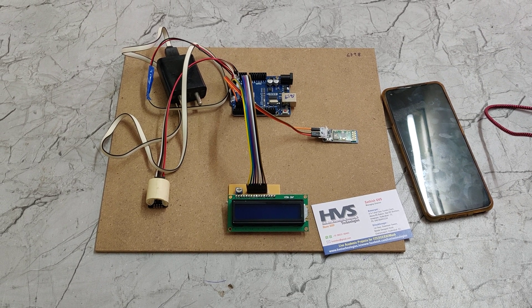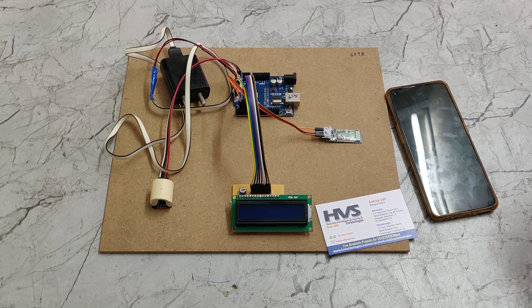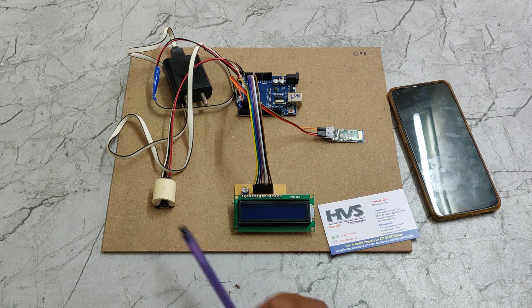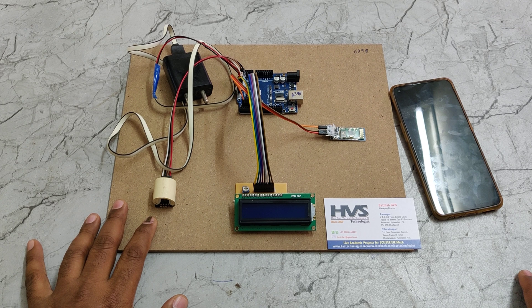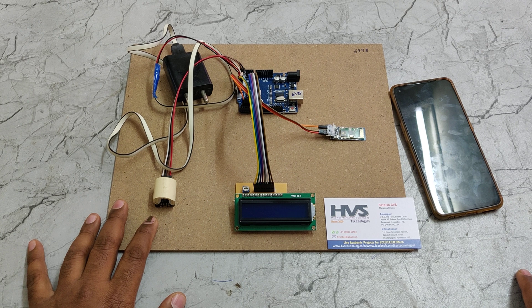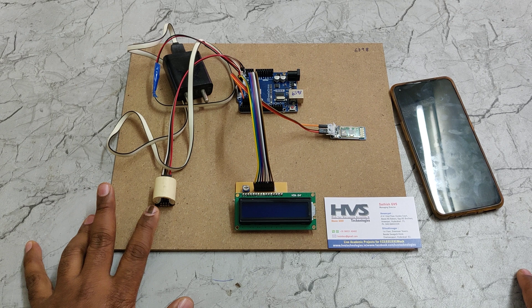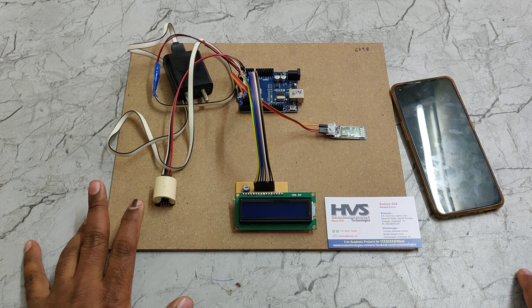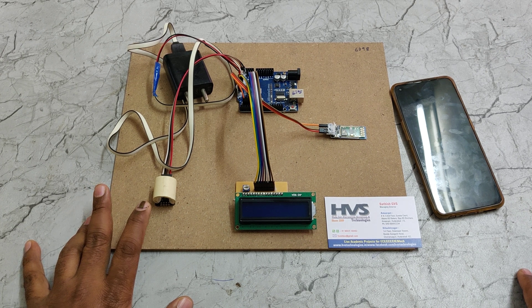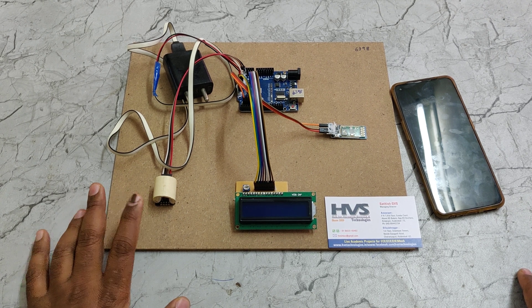Welcome to the project demonstration of a non-invasive glucometer using Arduino. Here we are using an Arduino board along with a customized sensor. In this sensor we are using mainly an IR LED along with a phototransistor and a red LED, which emits red light, and an LDR (light dependent resistor). The IR sensor is used to detect the finger, and the red LED is used to emit the red light.